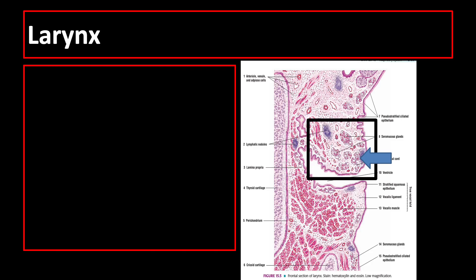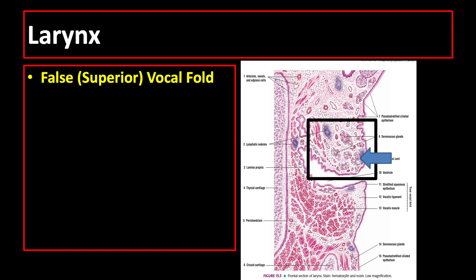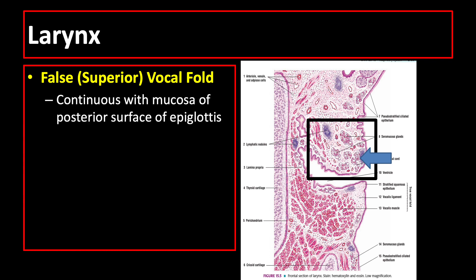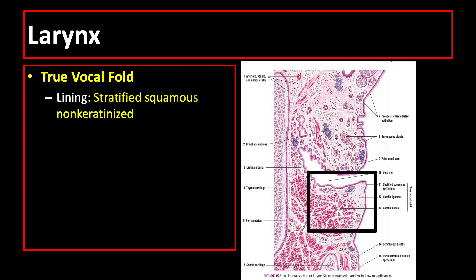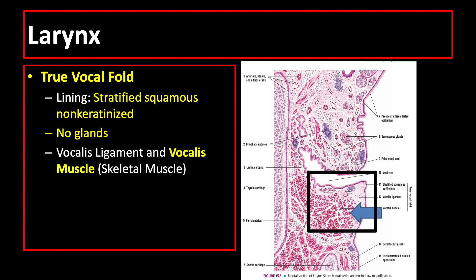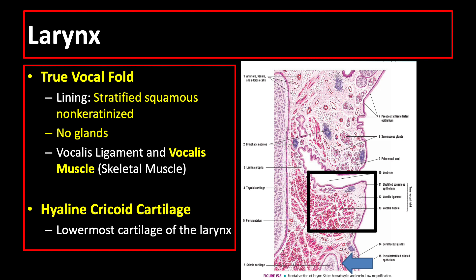The larynx has a false vocal fold, true vocal fold, and a ventricle. The false vocal fold is continuous with the mucosa of the posterior surface of the epiglottis and is lined by pseudostratified columnar ciliated epithelium with goblet cells. Underneath are mixed seromucous glands. The true vocal fold is lined by stratified squamous non-keratinized epithelium. Contrary to the false vocal fold, there are no glands; instead, you find the vocalis muscle, a skeletal muscle type. The cricoid cartilage, a hyaline type, is found at the lowermost portion of the larynx.